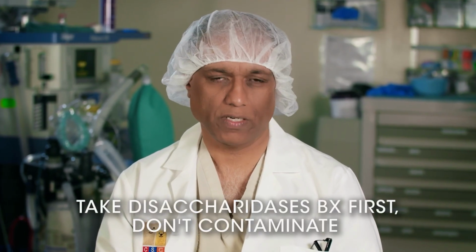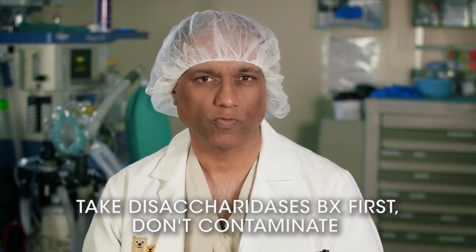Generally, you want to get that first because it's pristine, fresh, and the enzymes are not affected by any contamination from formalin. In the laboratory, it's a very old assay modified in the 40s that uses the appropriate substrate, and then the substrate hydrolysis makes a product, and then the product's measured. So the test is a simple principle, just much more refined and stable today. The results are pretty quick, and literally you will get results even before you get the histology back from other biopsies you've taken, so it gets you the data at the right point.